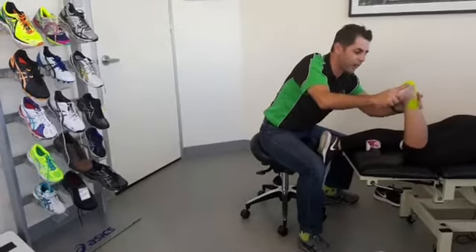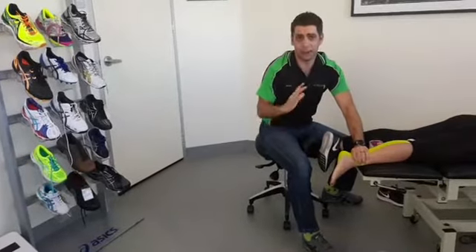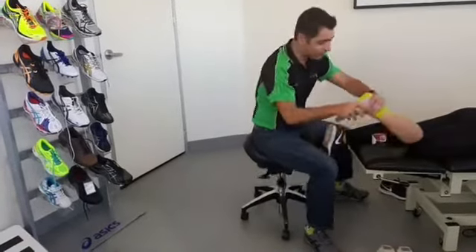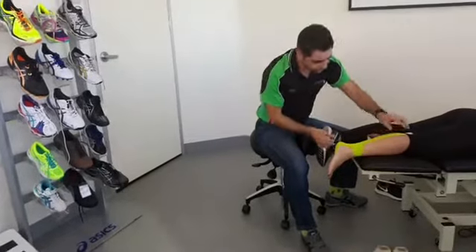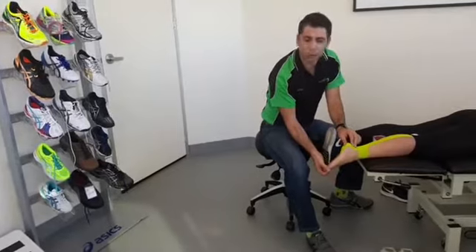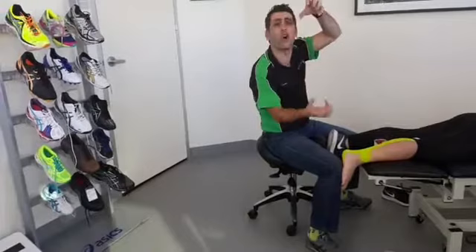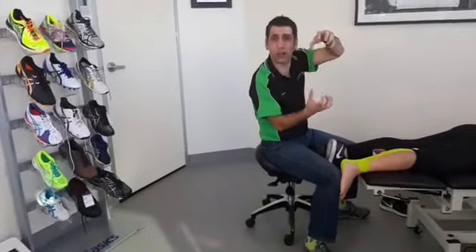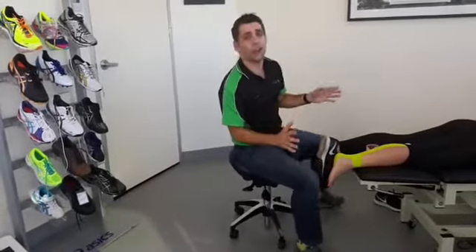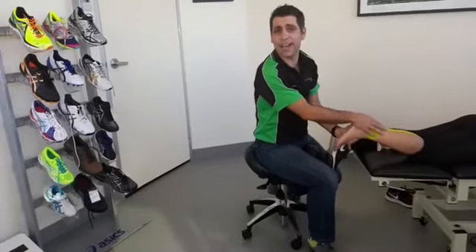So once you've got this foot with this very simple tape — how easy is that? Now what will happen is when the patient decides to get out there and do activity, the pull of the tape will pull on the heel and pull the foot into that pointed position. In effect, limiting or taking the stress — that long elongation or eccentric load — off the tendon. Two pieces of tape, simple as that. It works immediately, and you get groovy colours like the AC Podiatry green.